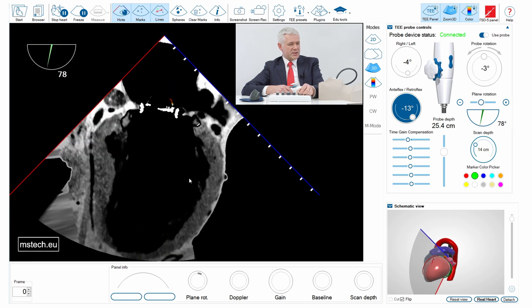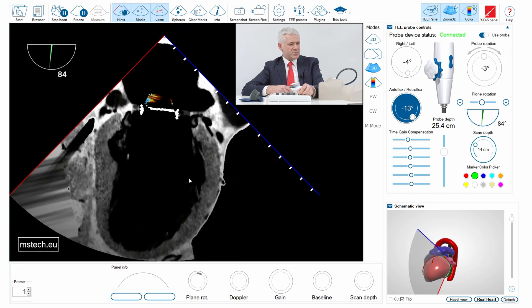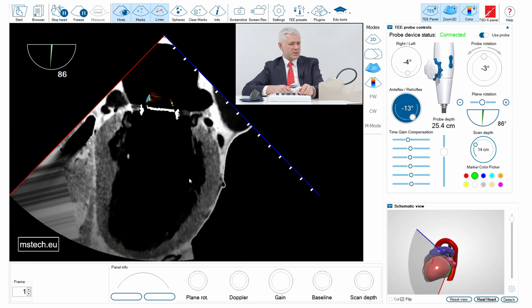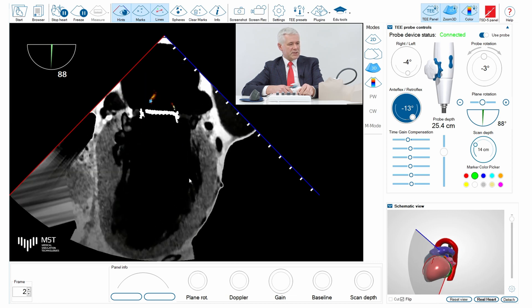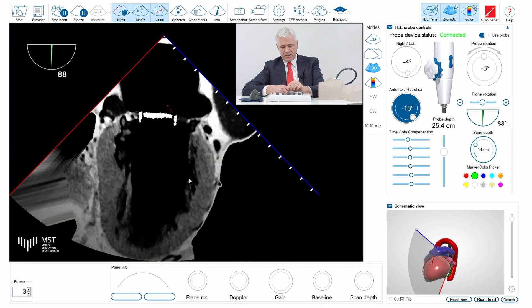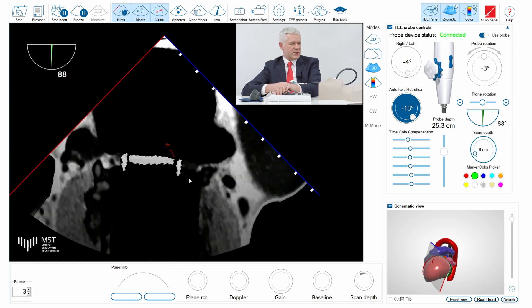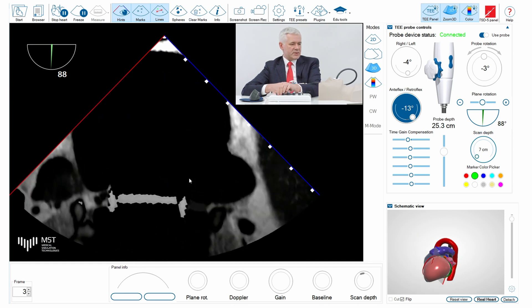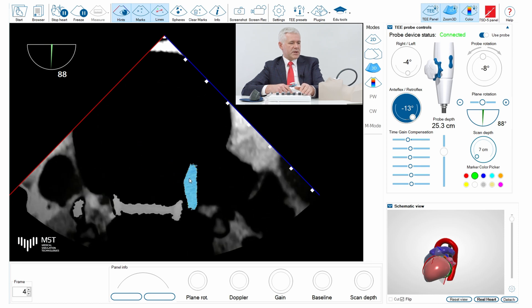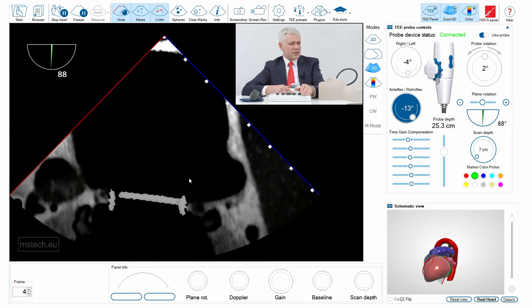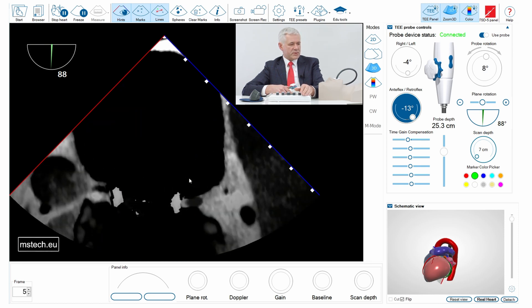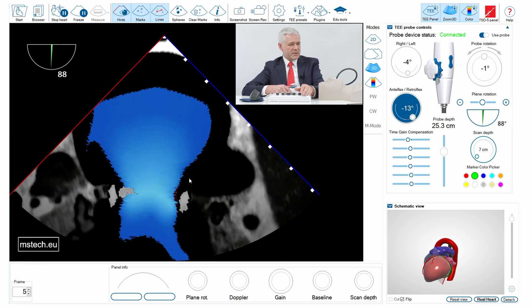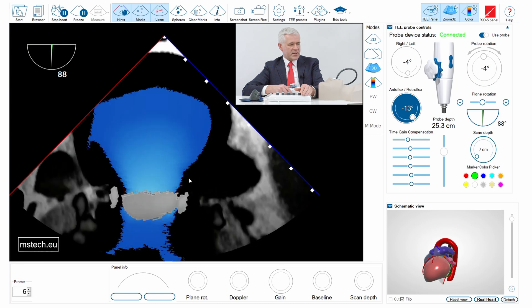When I increase the angle it disappears, and it doesn't appear on the other side. But here we can see the little jets in the center, so I will just decrease the depth to see it better. You see there are these little jets which are completely normal for a prosthetic valve — here they are.